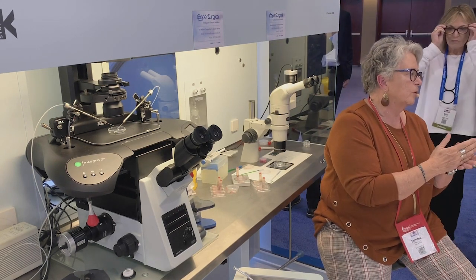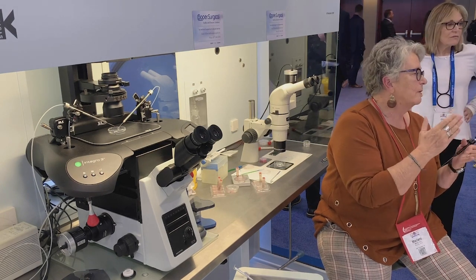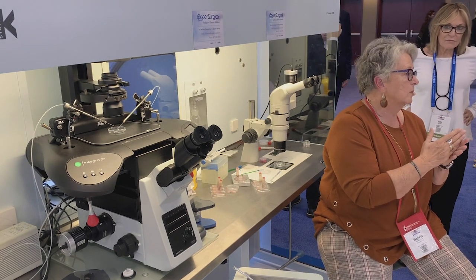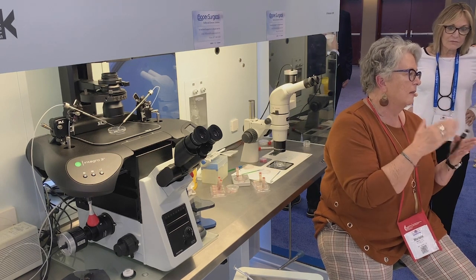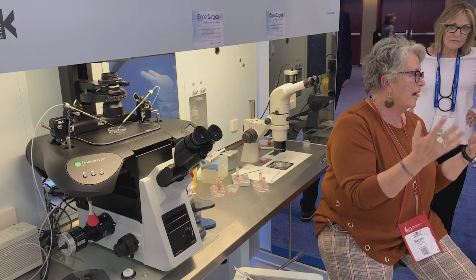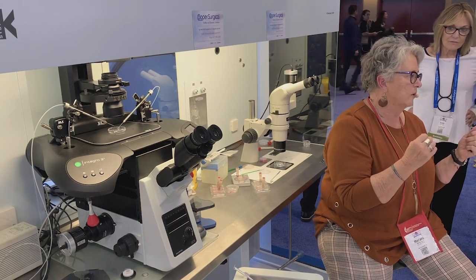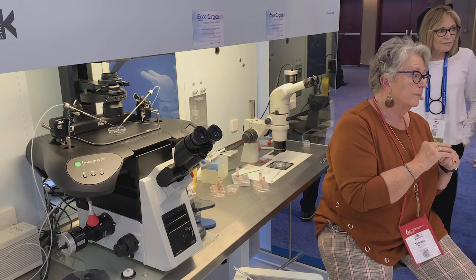They stick well on the VitriGuard, and they stick well on the CryoLock. They do not stick well on CryoTops or CryoTex. I like the devices if they're staying in-house, but if they have to travel, I want something those embryos are going to stick to like glue.